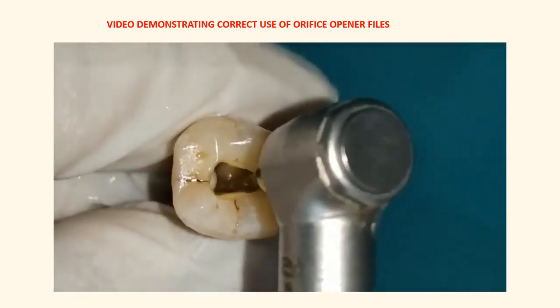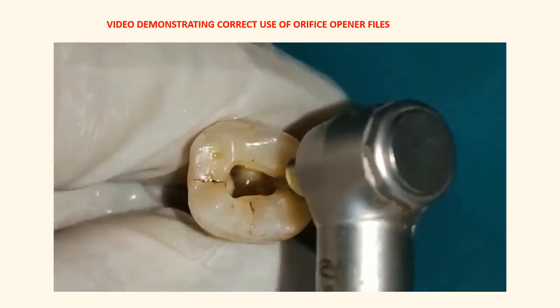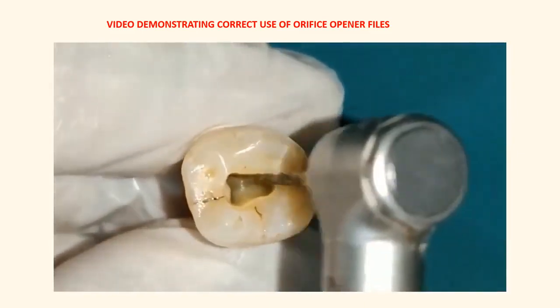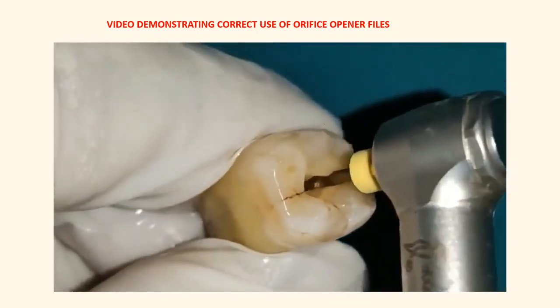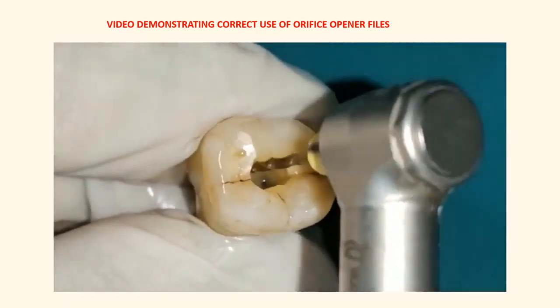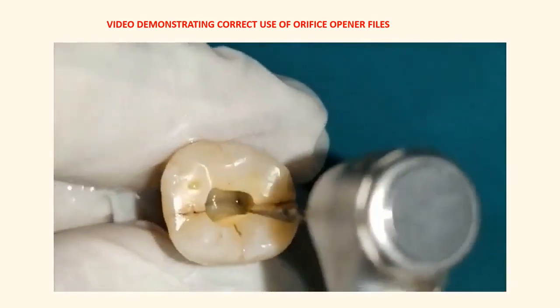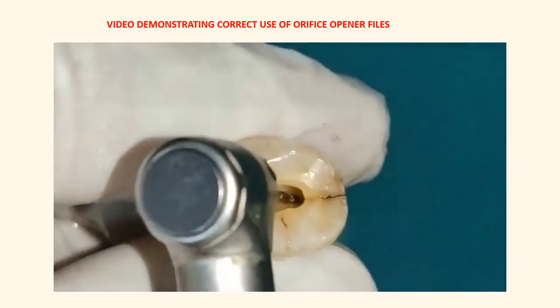See the motion of the file. Backstroke brushing motion with light pressure. Away from the furcation. I am not pushing the file down into the canal. Just brush and follow.